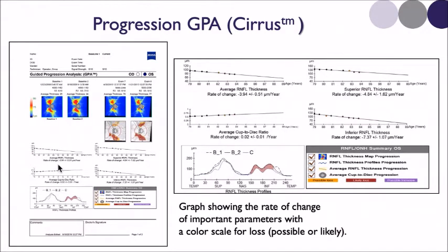Everything below that, these three graphs, are trend analyses. The upper one here is the superior RNFL thickness, here's the inferior, and here's the average overall. When these dots turn yellow or red, that's either abnormal or statistically significantly different for the first time or for multiple times. This is the RNFL thickness profile, and here the shaded area is significantly different than the baselines.